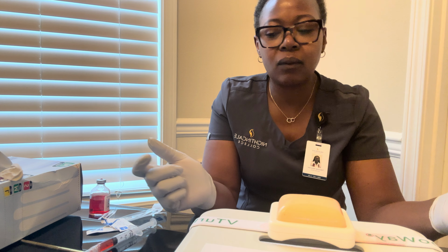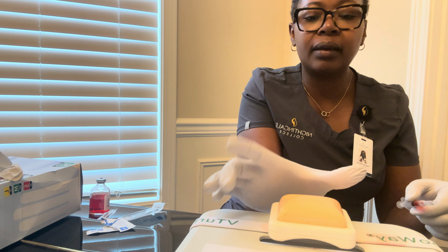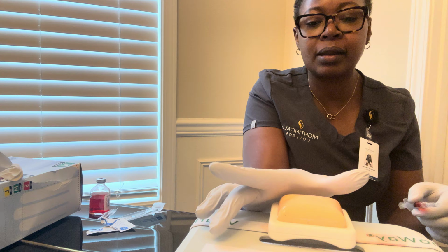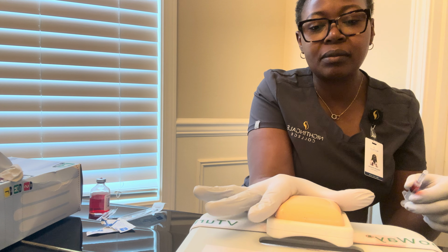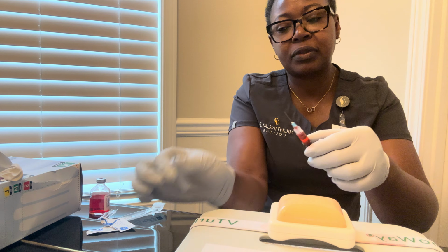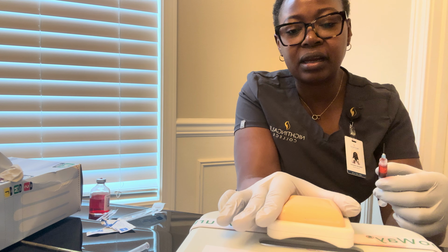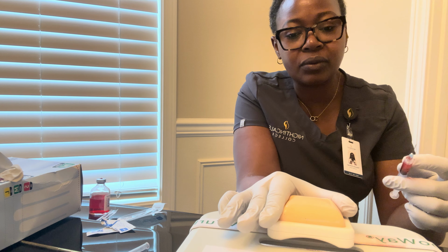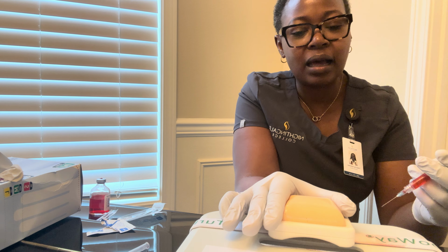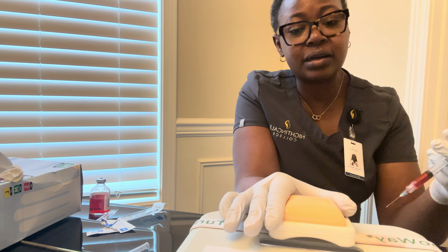I'll then go ahead and place my thumb and my finger towards the trochanter area, and then press. I intend to pinch the area to increase the muscle size, and then I'll advance at 90 degrees.